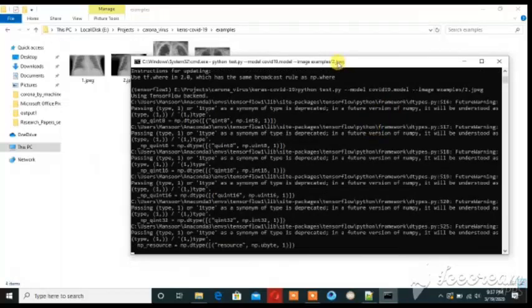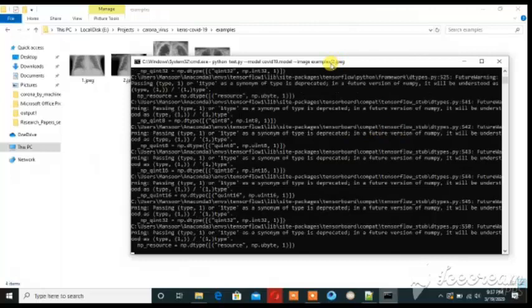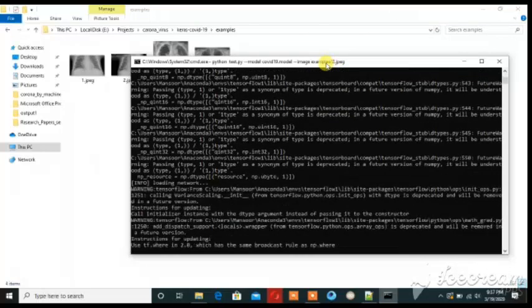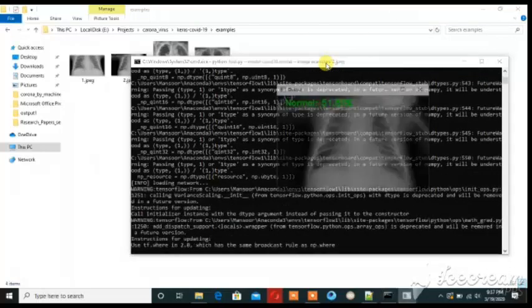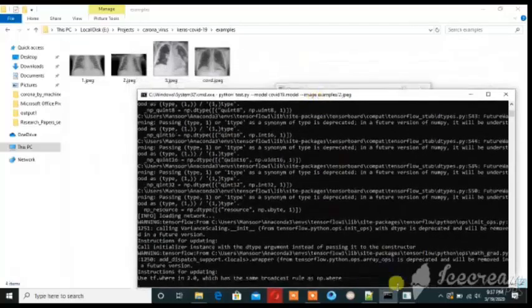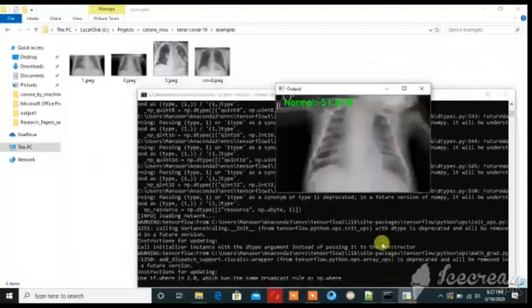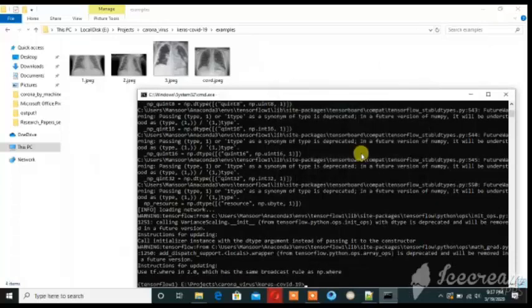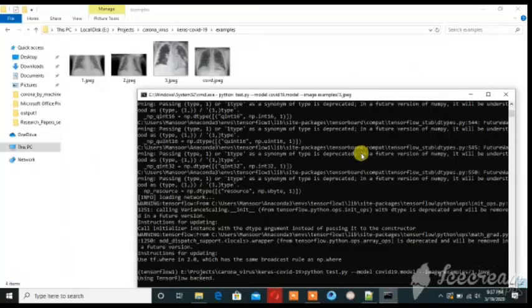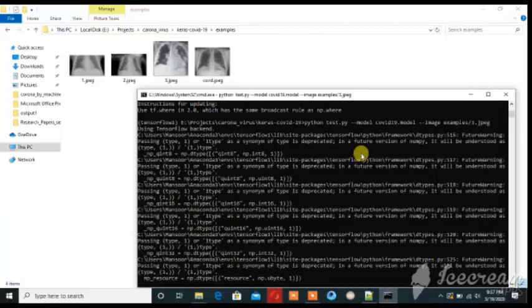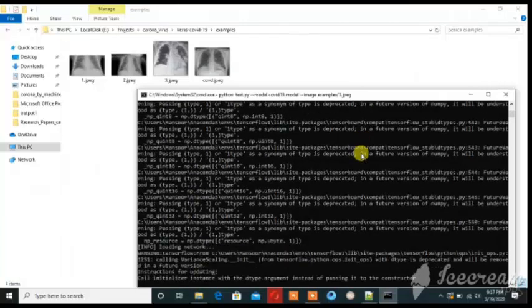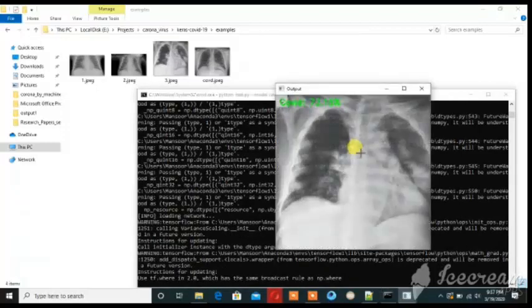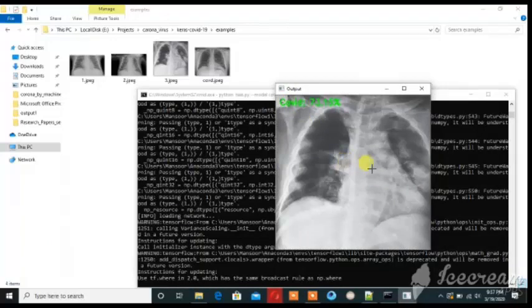Let's see second one. That is also normal. Now check that the person is affected by coronavirus. That is also normal. Now check that the person is affected by coronavirus. This is COVID-19 mean coronavirus affected person that is detected.